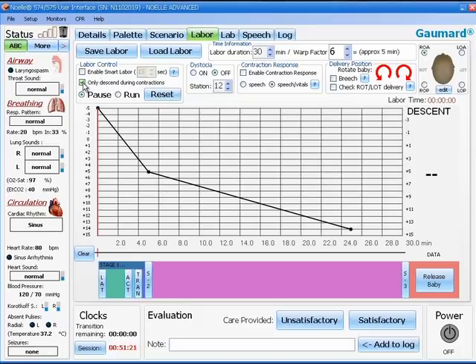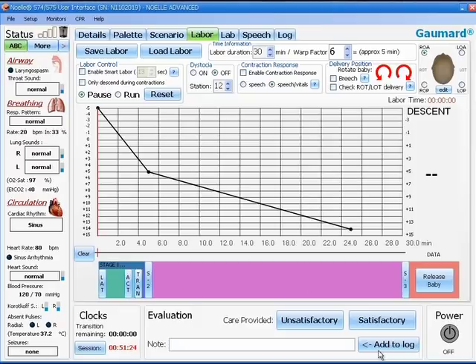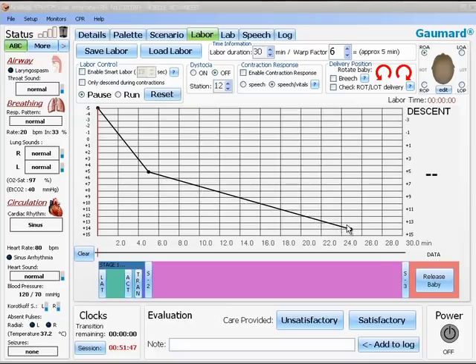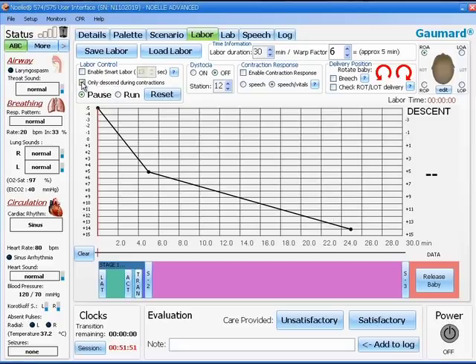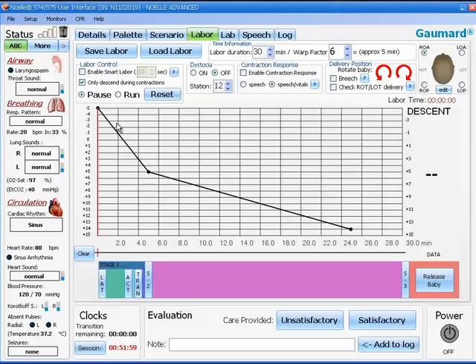The box below that is labeled only descend during contractions. If this box is not checked, the motor will continually run down towards the birth canal following the path set on the descent curve. If you check this box, the motor will only descend when there is a contraction. Thus the baby does not move towards the birth canal when no contractions are occurring.